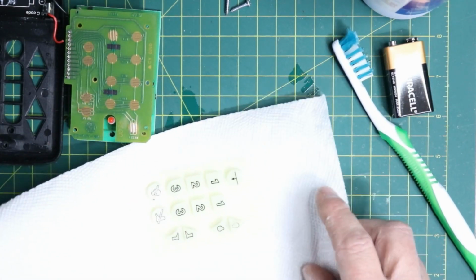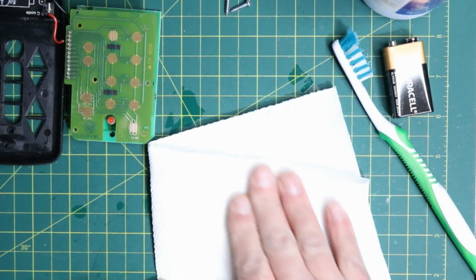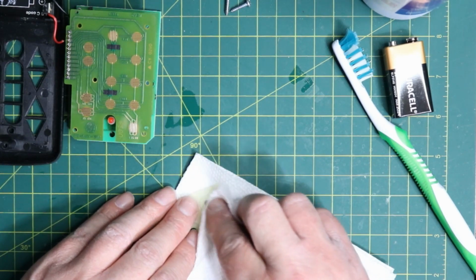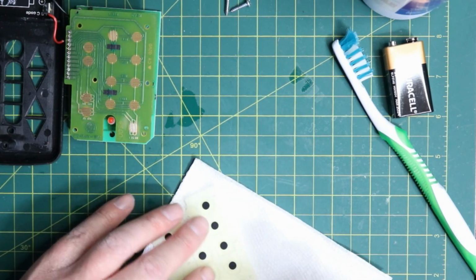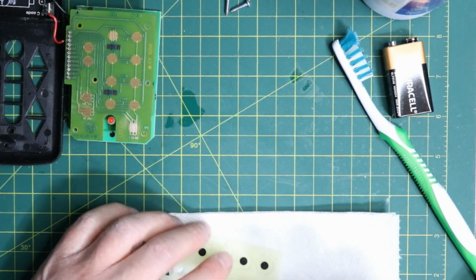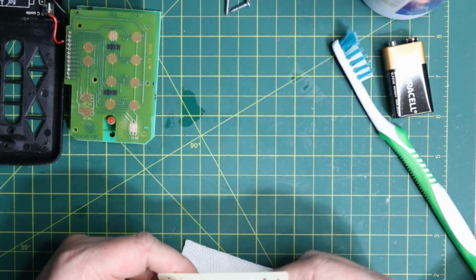So we're almost done cleaning this up. It's looking pretty shiny there, so I'm quite happy with that. And then we'll go ahead and get that guy soldered up here, and then we'll go ahead and button it up. So I'm just going over it again here, just on the black pads, to get rid of any impurities that might be on there as well, to prevent it from making proper contact on the PCB there. So we want to make sure that we always have a good contact on there.